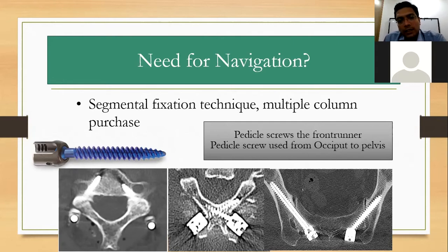And with the use of these pedicle screws, somewhere it became relevant as to how optimally they are placed to get the best biomechanical hold from these screws. Optimal placement and accurate placement was the need of the hour, and navigation was as a result born, where you would use navigation technology to get optimal screw positioning.